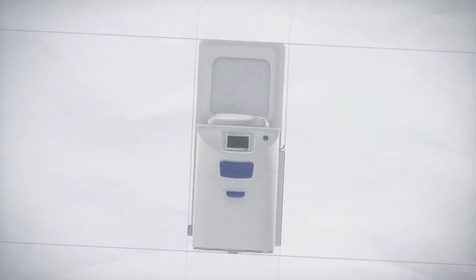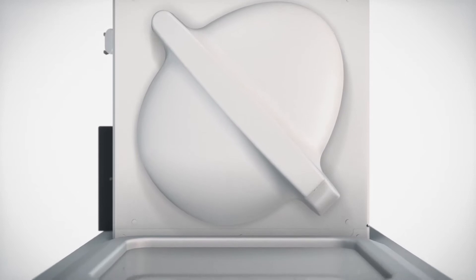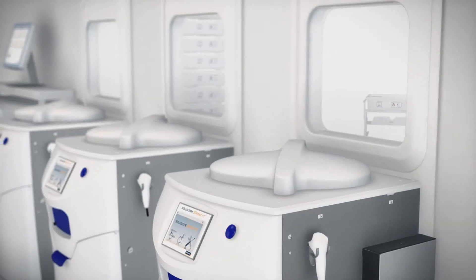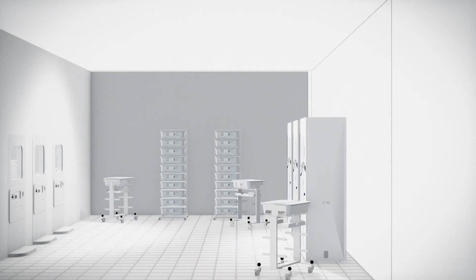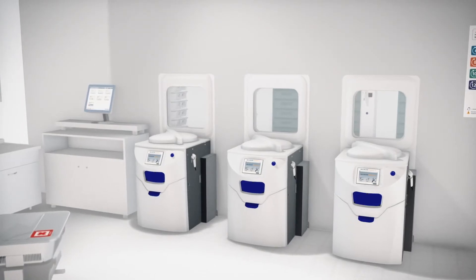For more than 25 years, SoluScope has been working with healthcare professionals to provide secure and safe solutions in endoscope reprocessing. The SoluScope Sprint Pass-Through is a remarkably efficient and reliable endoscope washer disinfector that enables one-way workflow implementation in your department.